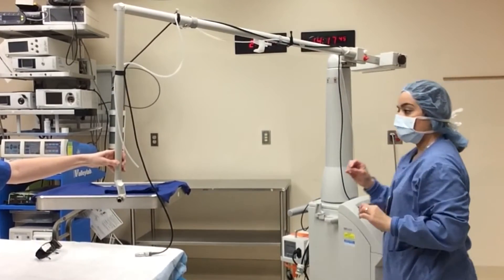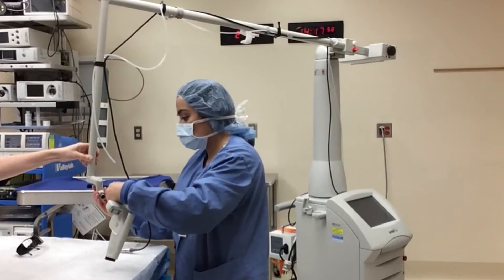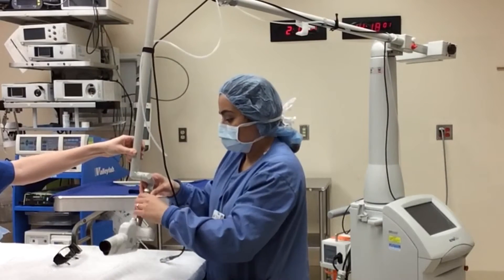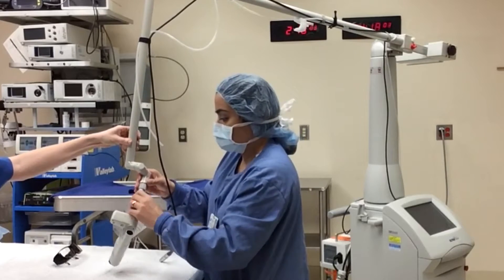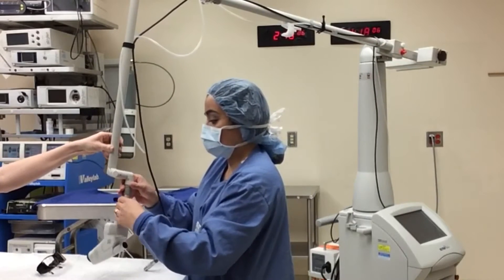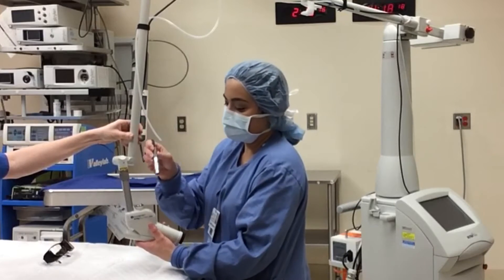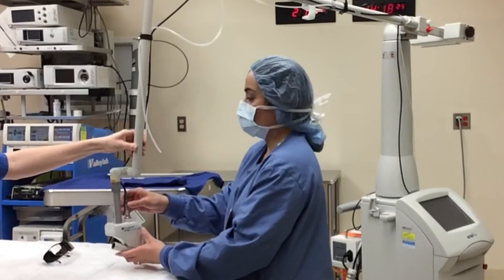The arm is not balanced yet, so you may want an assistant to help you while the laser handpiece is connected. Using a twisting method, much like a soda cap onto a bottle, connect the handpiece to the laser arm. Once the handpiece is connected, connect the computer cord from the laser to the handpiece.